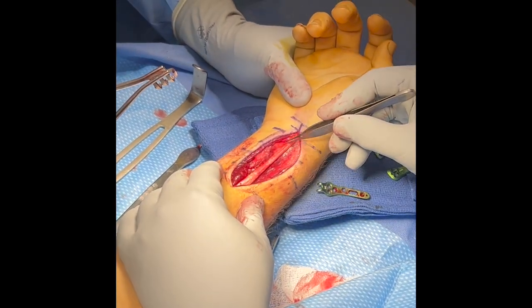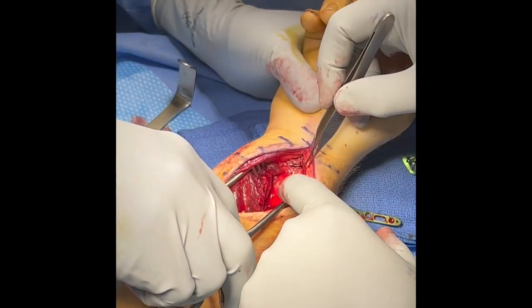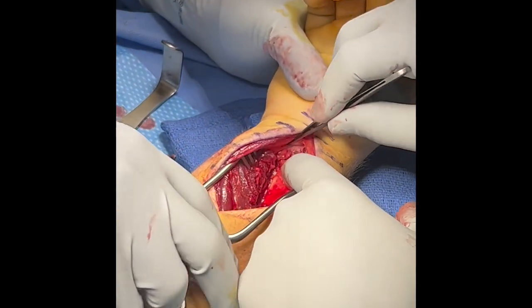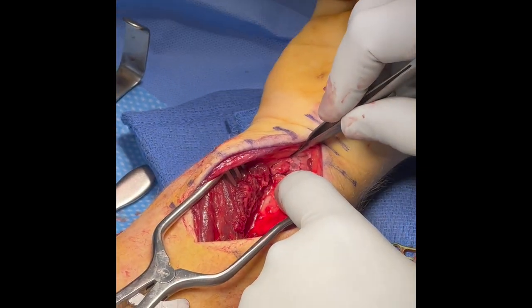A standard approach is made to the distal radius. The flexor carpi radialis is retracted radially, the flexor pollicis longus is retracted ulnarly, and the pronator quadratus is released, exposing the very distal intra-articular fracture.